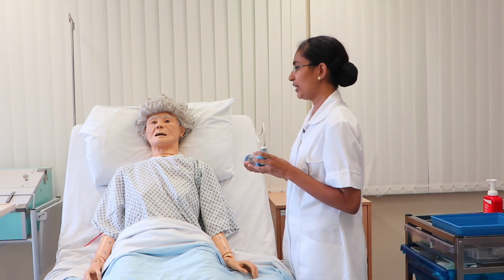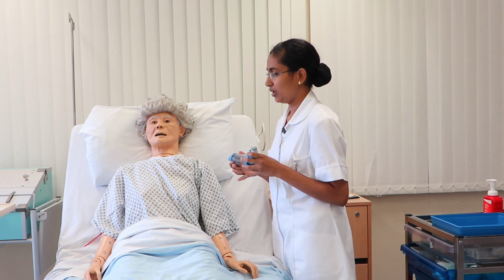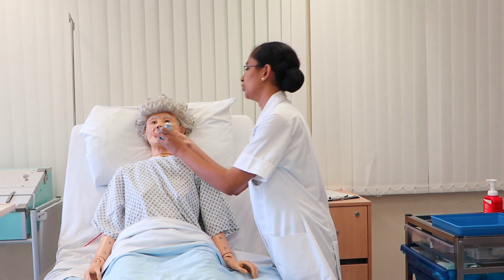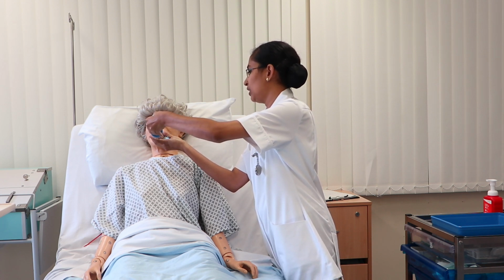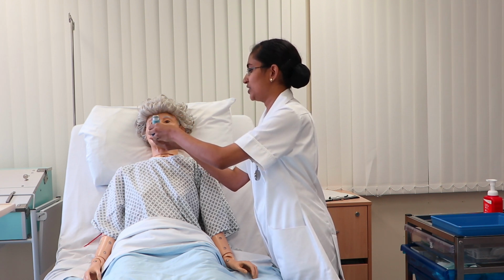Okay, Bob, shall we have the set of respiration now? Inhale, exhale, inhale, exhale, mouth to mouthpiece. Seal it with your mouth and I will press it. Can you just tilt your head backward a little bit? Okay. Now I will press the canister. Can we have 5 cycles of respiration?